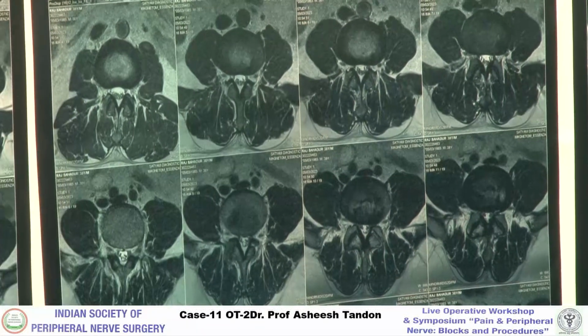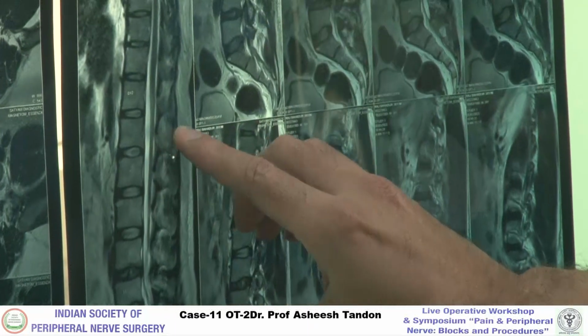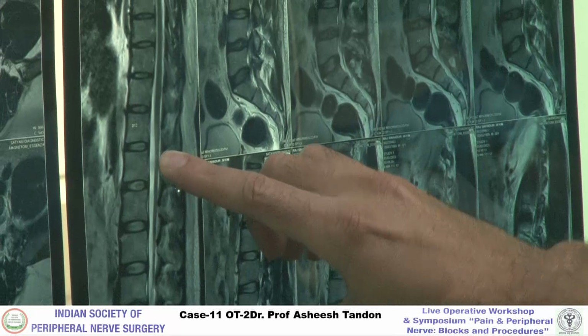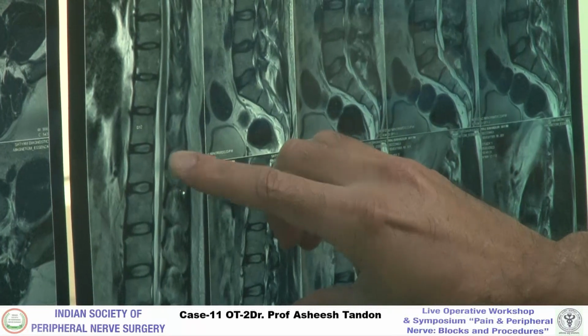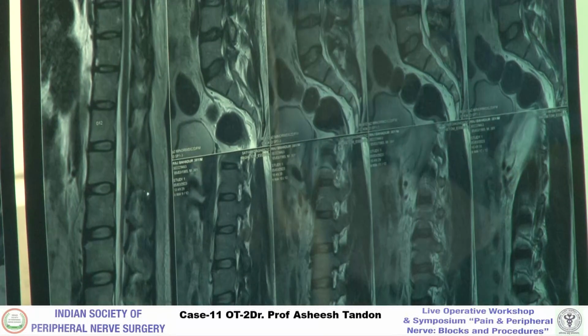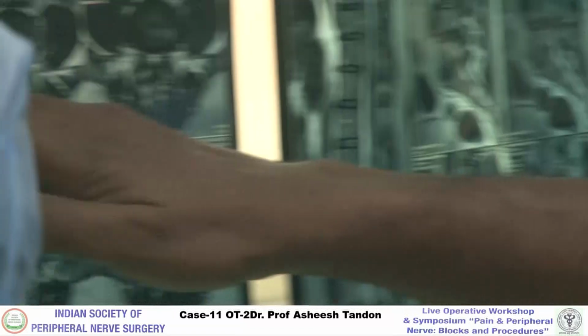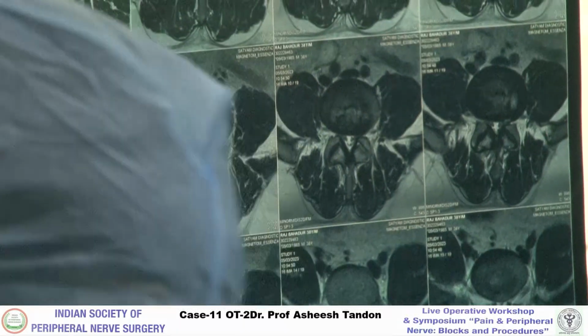Conus, can you show? Yeah, why not? Conus is ending somewhere around this. Yes, D12, L1. Correct, it is ending here. Correct. Yes, sir.